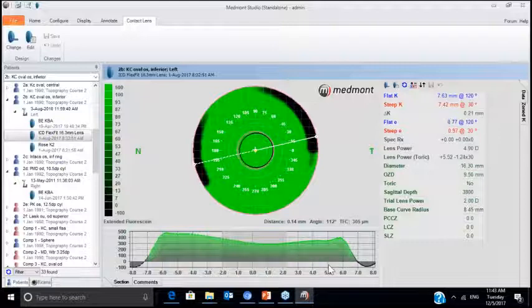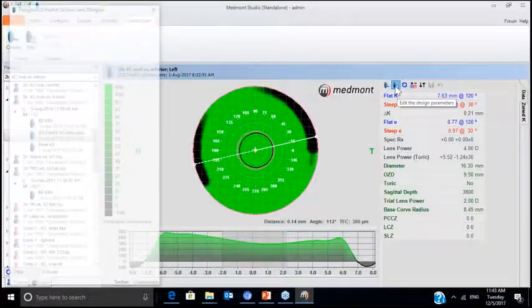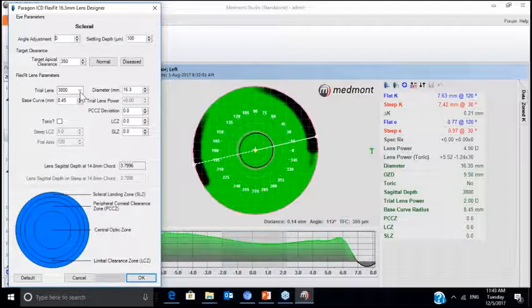So here what you see is our scleral lens with 291 microns of apical clearance, and it's landing, sinking into the conjunctiva, the average 125 microns that the lens normally compresses the scleral tissue. So you've now placed a scleral lens, and we've gone well beyond the borders of the cornea.